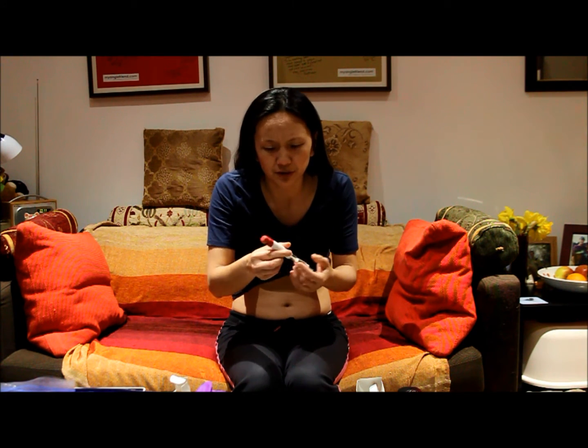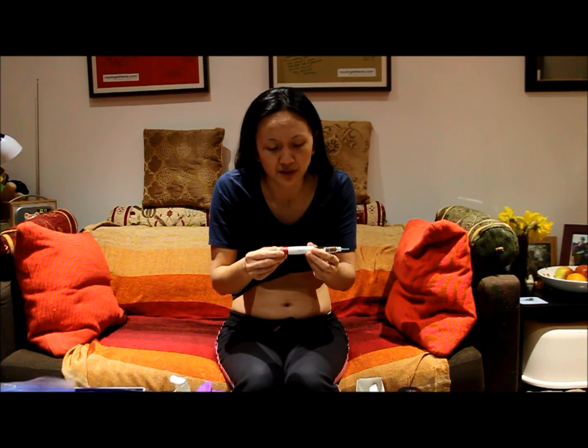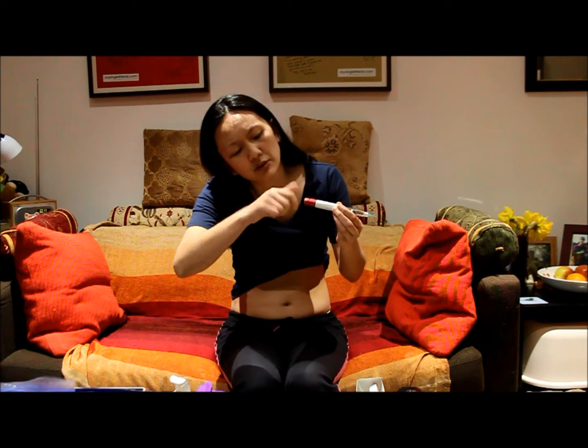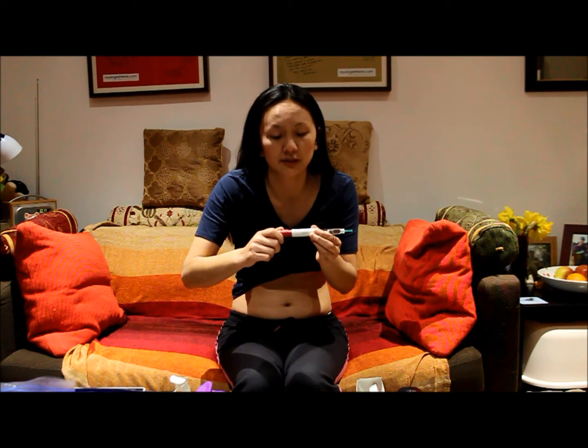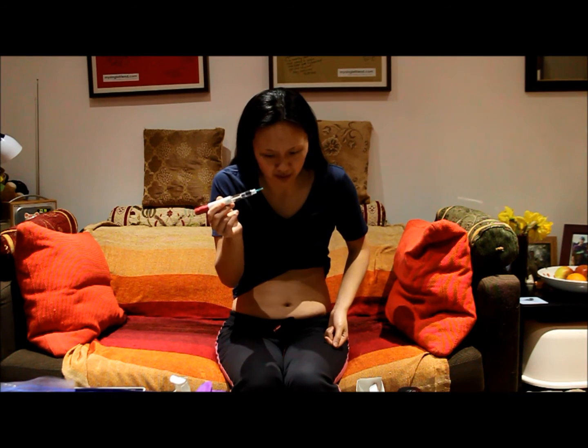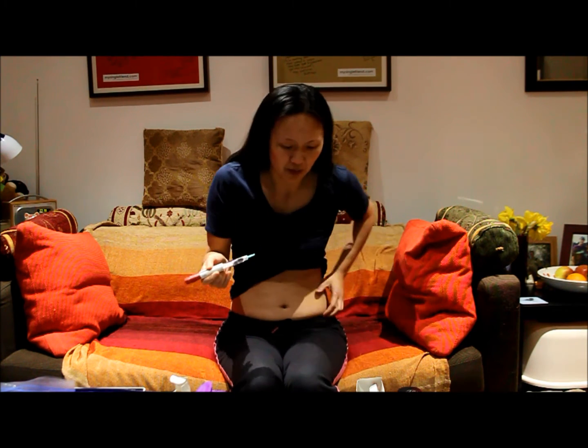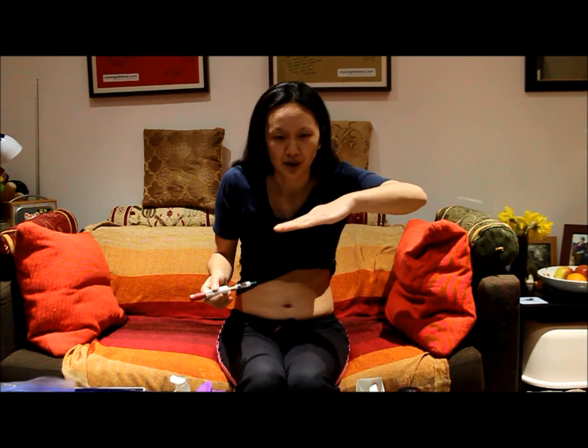According to the pen window I've got 600 units left — always good to check how much you've got left so you know whether it's going to run to zero. Next I'm going to dial up my 300 units. This goes up in increments of 12.5 — I'm going clockwise all the way up to 300. If I went too far to 312.5, not a problem — I just turn it back anticlockwise and it's back down to 300. Don't push down yet. I've still got my green inner shield on.